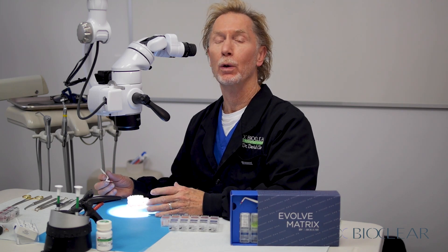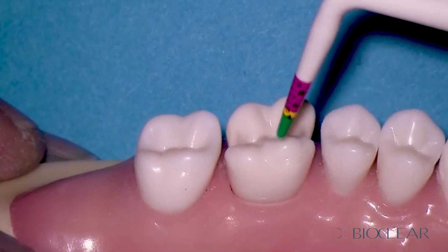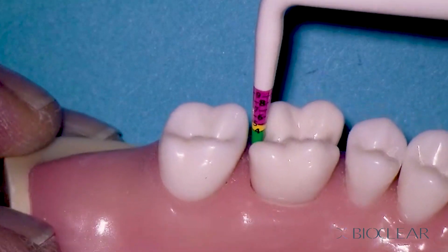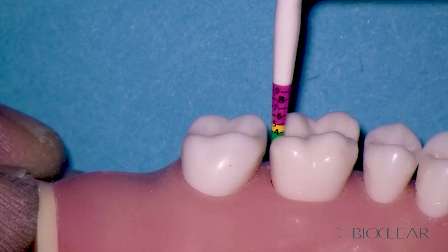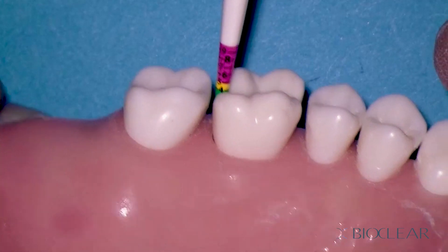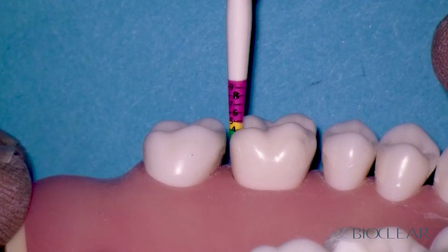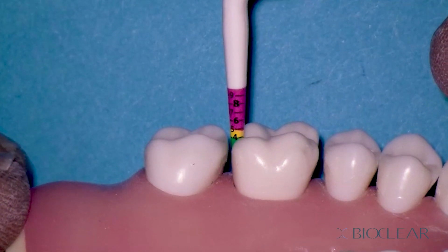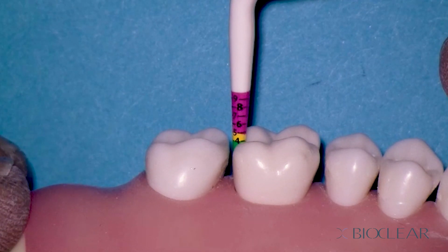Once we've finished the cavity preparation — blasted and ready for injection molding — we drop the matrix height indicator into the cavity preparation. Looking from an oblique angle, take a look at the marginal ridge of the neighboring tooth, or the shoulders or cusps of the tooth being restored. In this particular case, looking at the distal, it's about four millimeters. This overlaps with the go/no-go coloration — it's absolutely a go, it's in the green zone. We will not need to layer, so we can injection mold with one shot on the distal.